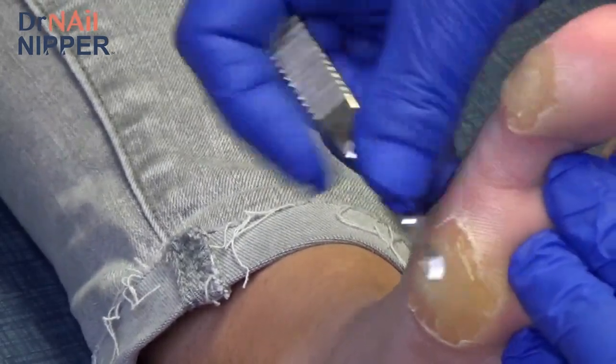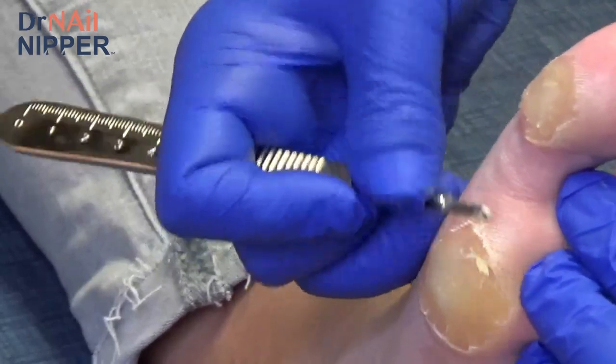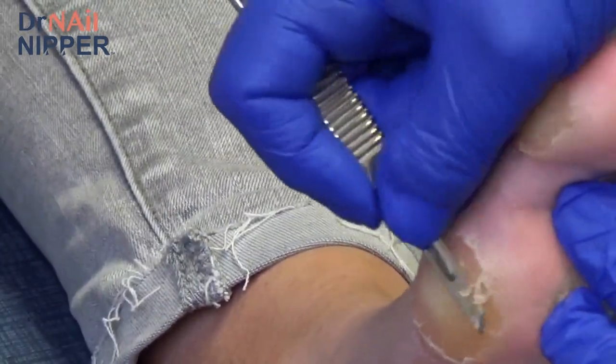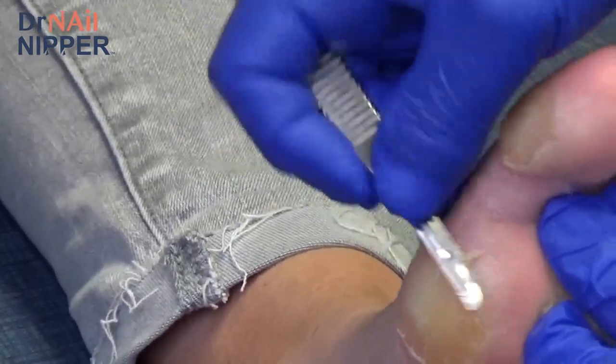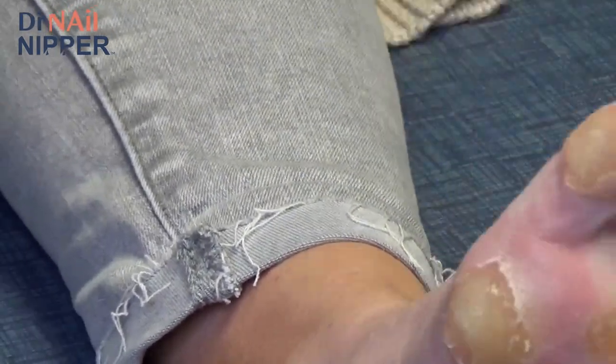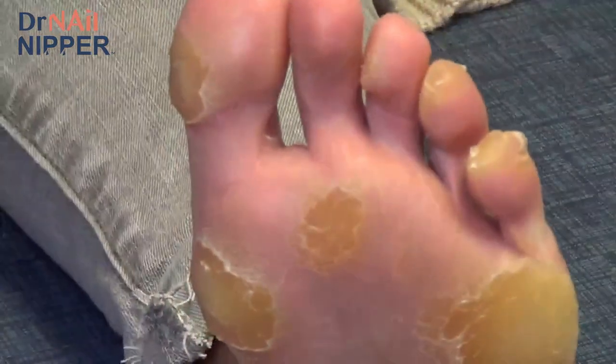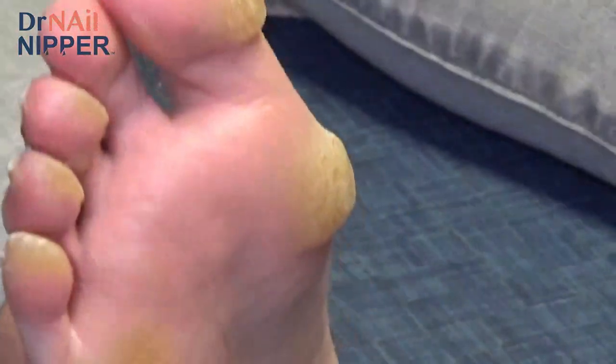Okay, so I'm going to have you just feel these and tell me if there's spots you want me to go a little bit deeper. No, that's better. Good? Okay. So I'm going to put a new blade on for the right foot.